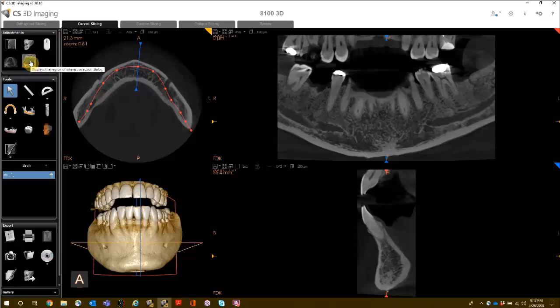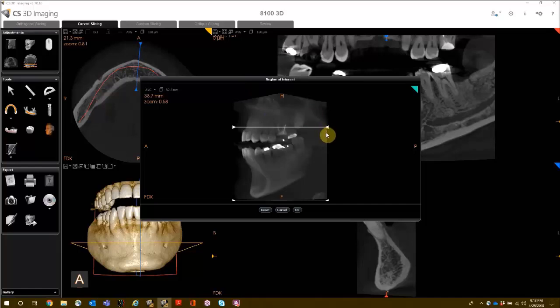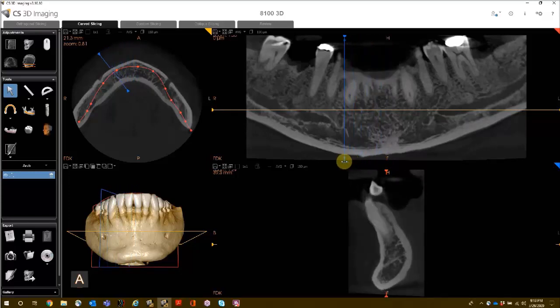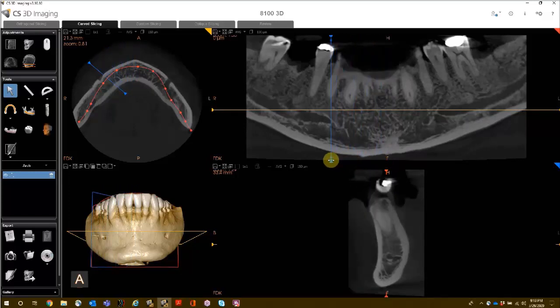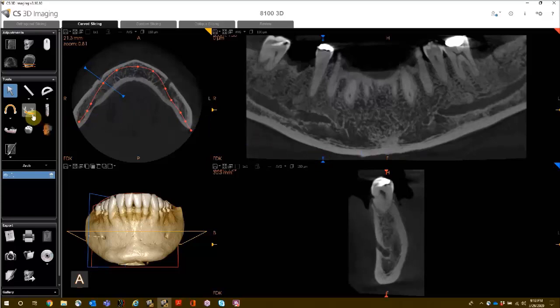In your Adjustments tools, select the region of interest and remove the maxillary teeth, as we do not need them right now. You now have a bigger view of the mandible. In your reconstructed panoramic view, slide your blue handlebar to the opening of the mental foramen. You should see the opening of the foramen appear on the lower right screen. Once you see the opening, you are ready to trace your nerve — activate the Nerve Canal tool in your tools.